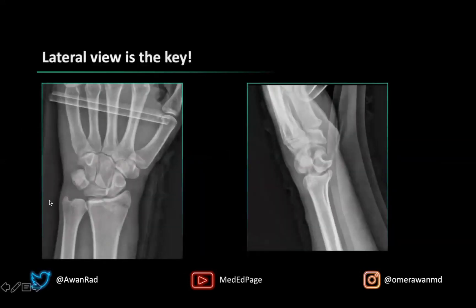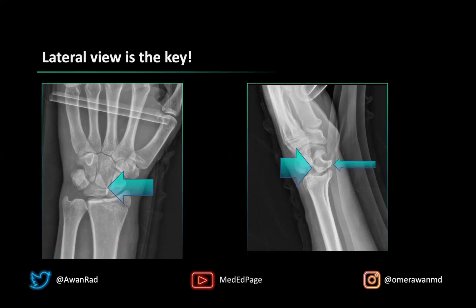The lateral view is key because we have this pie-shaped lunate on the frontal view, but the lateral is what gives this away. The lunate should be sitting right on top of the radius, but it has actually been dislocated 90 degrees anteriorly or volarly — toward the palmar aspect of the wrist. This is diagnostic of a lunate dislocation.